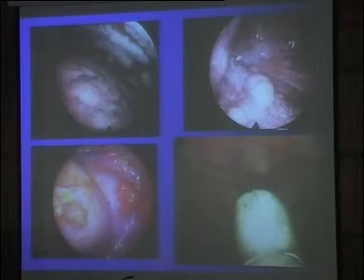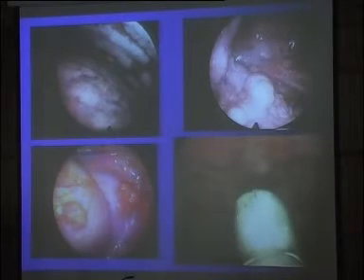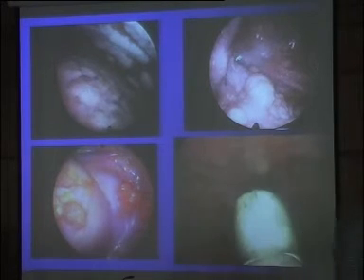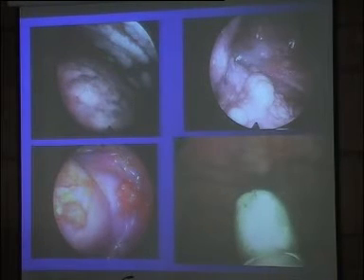Okay, I understand now. When you use a second point of entry, the position of the physician is important. Our colleague surgeons are on the back of the patient. We are facing the patient, because when you enter into the pleural cavity using the middle axillary line, you are in front of the posterior parietal pleura where there are stoma, etc.